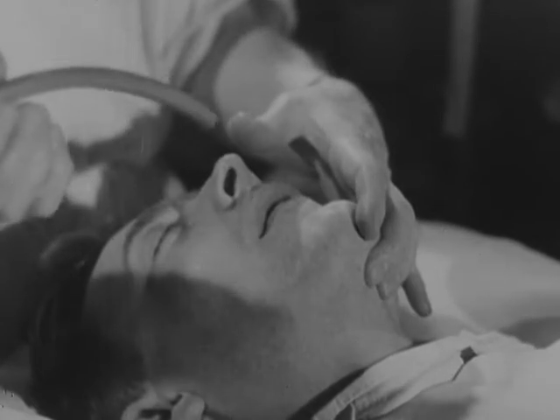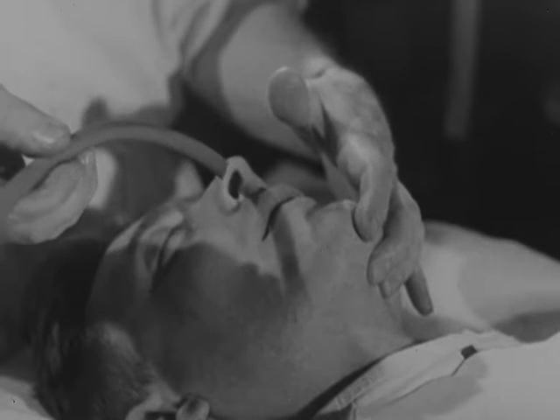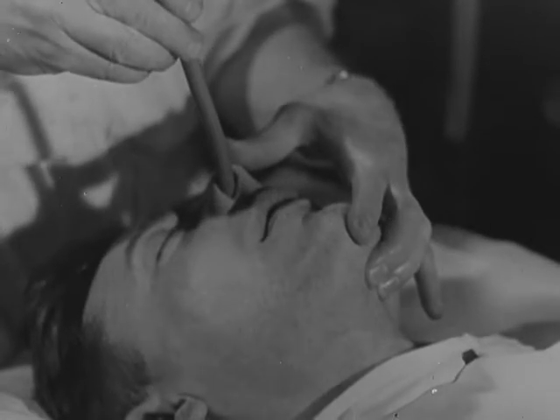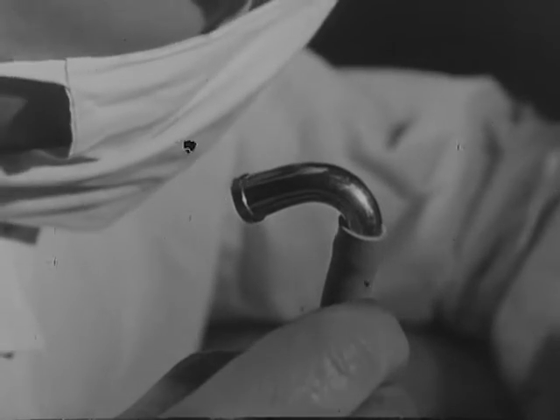Now the same process in slow motion photography. Successful blind intubation depends entirely on the sense of hearing. So the anaesthetist must listen carefully to every sound that comes through the tube. If the ear is kept close to the end, the current of air can be felt as well as heard.